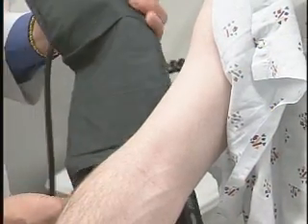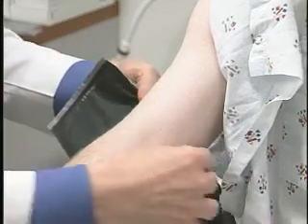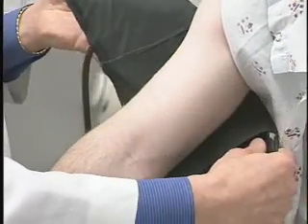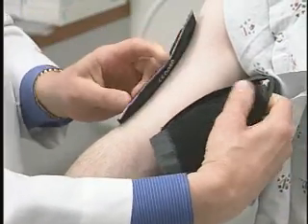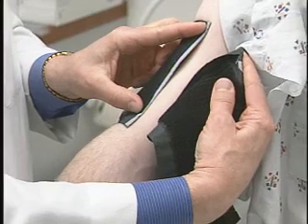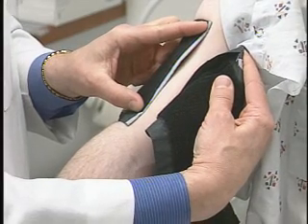Also, determine the total length of the bladder of the blood pressure cuff, which is where the tubes come out of the blood pressure cuff. When you wrap the blood pressure cuff around the patient's arm, it should approximately be at least 80% of the circumference of the arm.